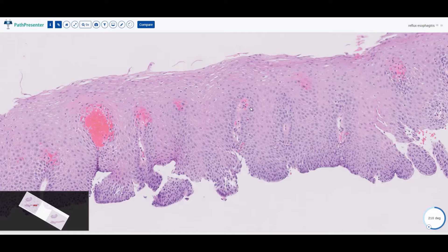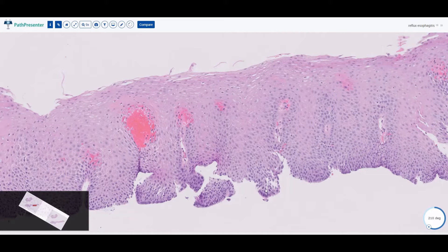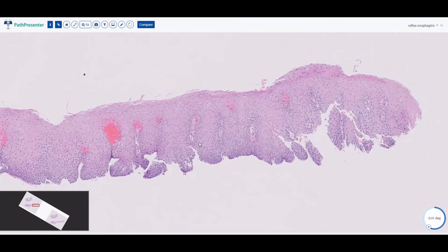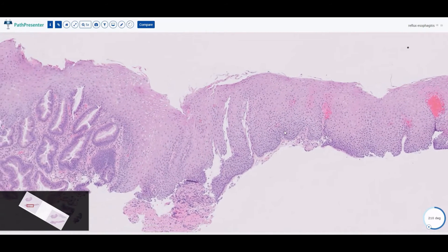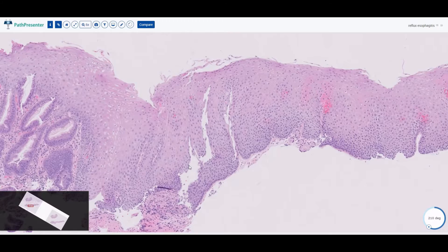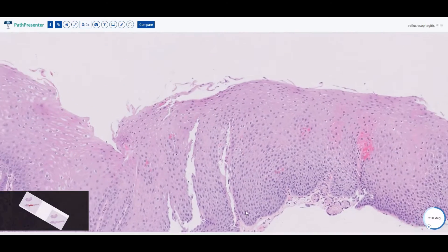Another common feature associated with epithelial reactivity is the finding of papillae within the epithelium that extend far up. Normally, papillae should be no more than one-third to one-half of the full length of the epithelium, but as you can see these papillae reach very high up — probably located in the upper two-thirds of the epithelium. This elongation of the papillae is a common association with reactive features.